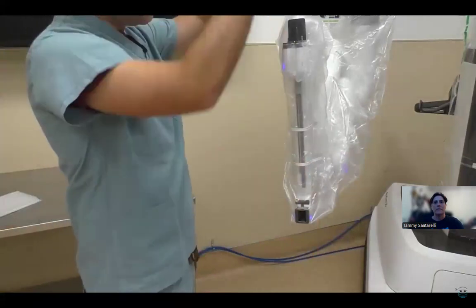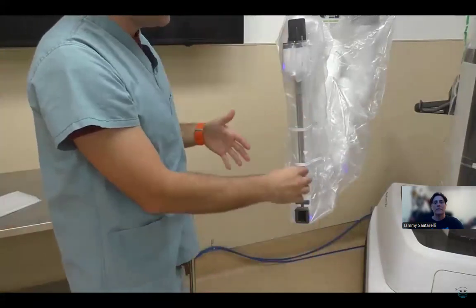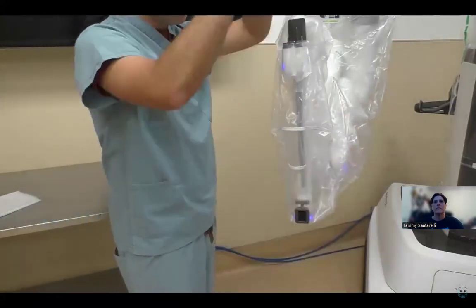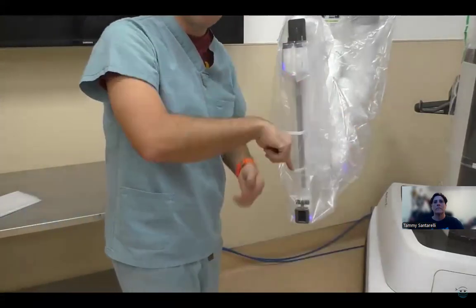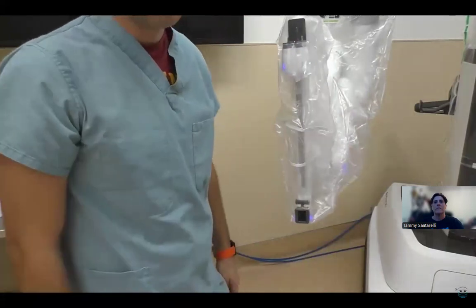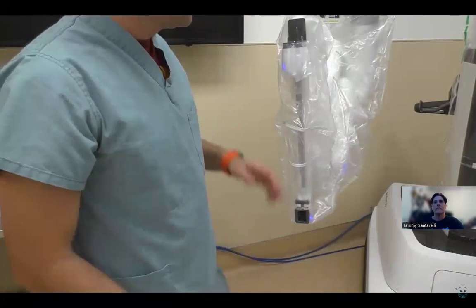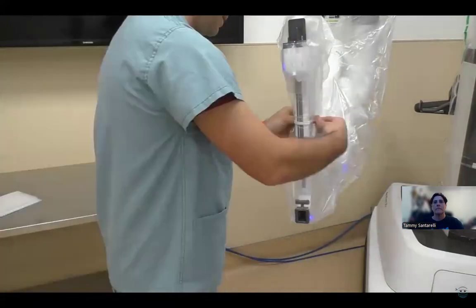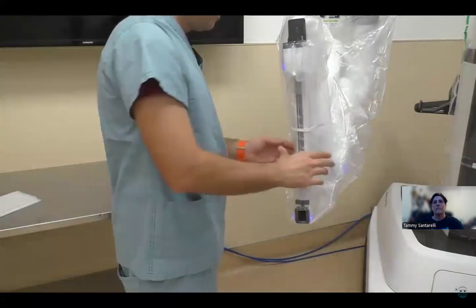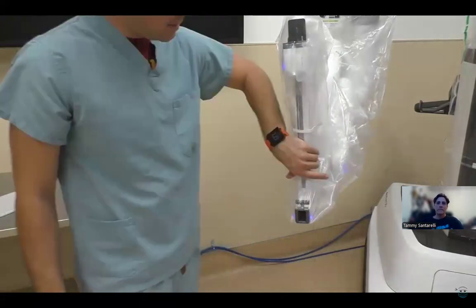So it's easy to insert the instruments directly into the trocars. If this is out like this and you go to insert an instrument, you might accidentally puncture this drape and completely contaminate the instrument itself and the case. So take these malleable little plastic pieces and just push them back into the arm to keep that drape out of the way.